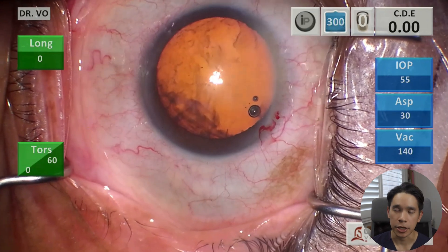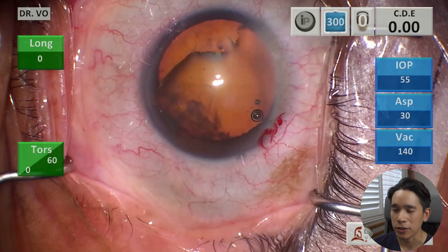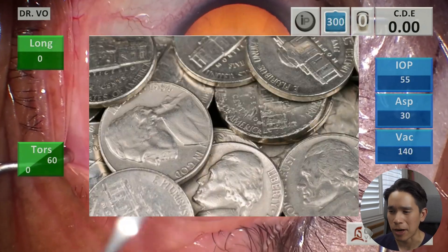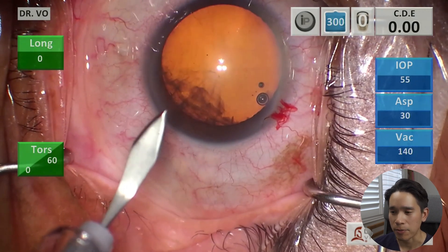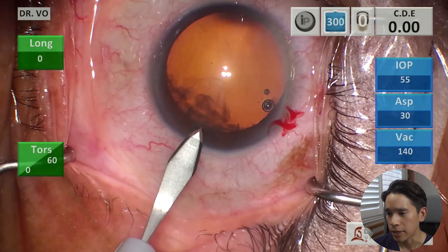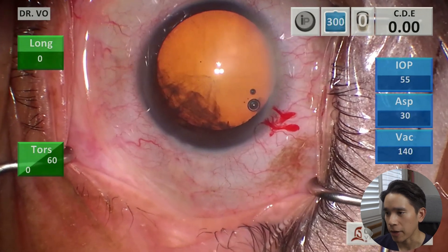The main incision during cataract surgery is actually only about two and a half millimeters in width, so it's still a very, very thin incision. If you think about how a nickel is only about two millimeters in thickness, this is only about 25% thicker than that. So here is the primary incision, and this is for my dominant hand, which is my left hand.